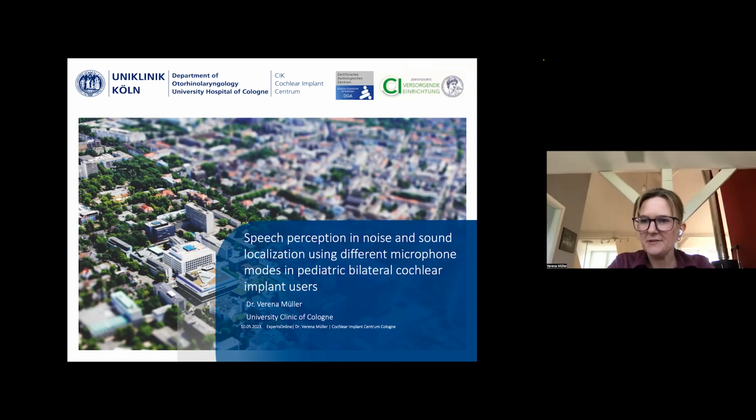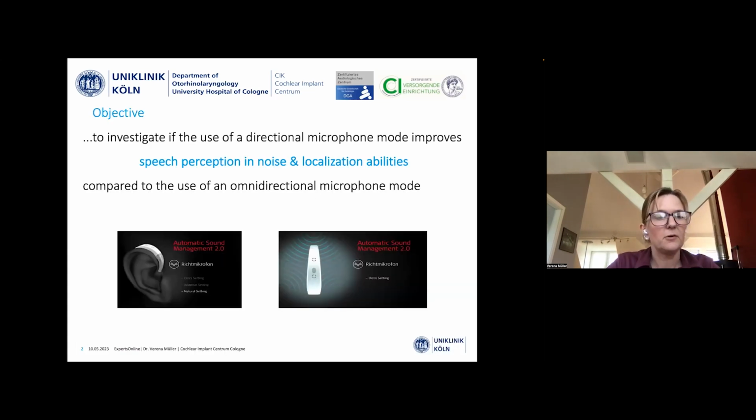It's a pleasure to present my study that we did some years ago, actually. And we did a study with experienced bilaterally implanted children who were using an audio processor from MED-EL. And we wanted to investigate if the use of a directional microphone, thus the natural or the pinna imitating microphone, improves speech perception in noise and localization abilities compared to the use of the omnidirectional mode.